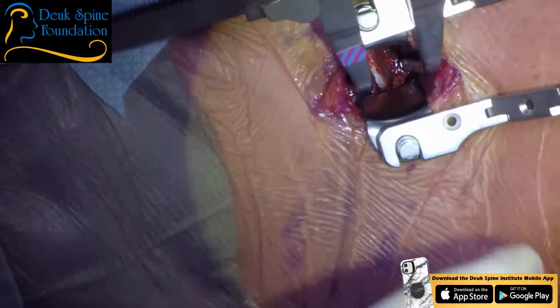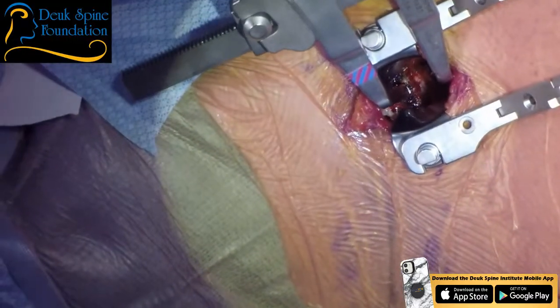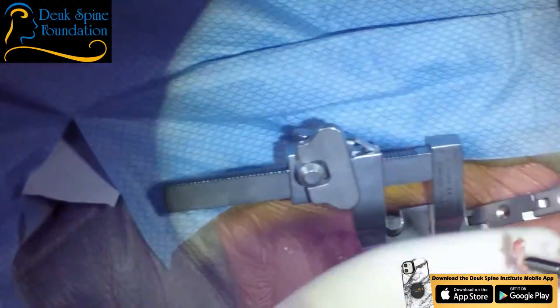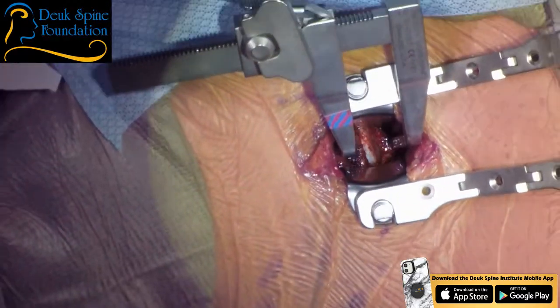All right, we've done a really good discectomy. Everything's looking good. Pituitary, I see that disc piece you're after. It's right here. Okay, a little piece of cartilage. Okay, let's get the microscope in, everyone.